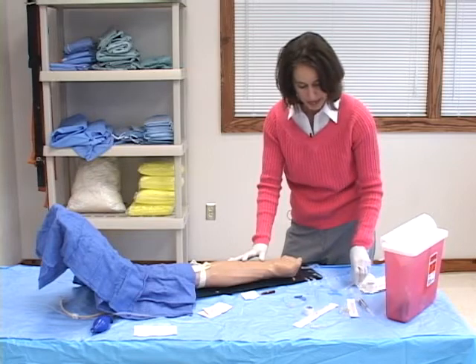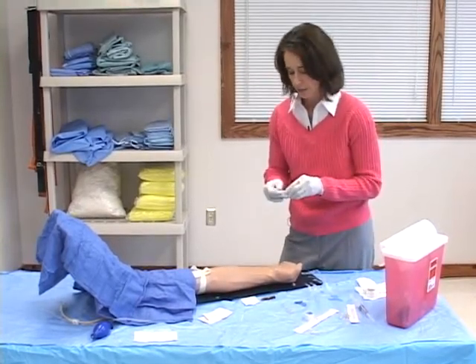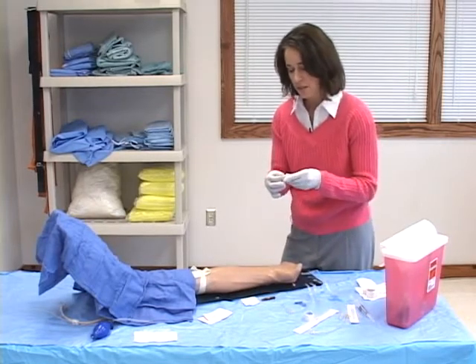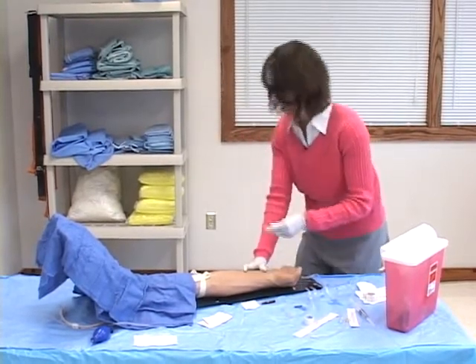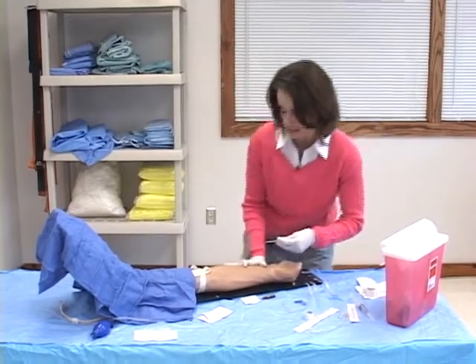So I'm going to get my catheter. As I mentioned, it's a 22 gauge catheter that I'm going to be using. I'm going to remove the cover. And with my catheter needle, I want to make sure when I'm planning on entering the vein that the bevel is going to be up. I'm going to apply my traction, and I mentioned not hunching down over the patient, so I'm going to go ahead and have a seat on the stool that is behind me.